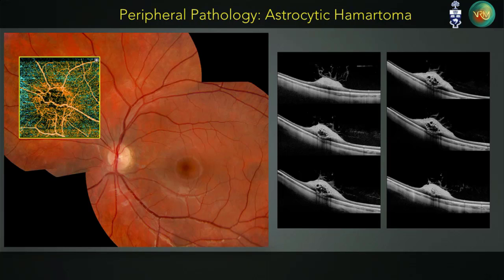And that's the OCT-A of that case. So you could even take OCT-A somewhat peripheral in this early stage of swept source.